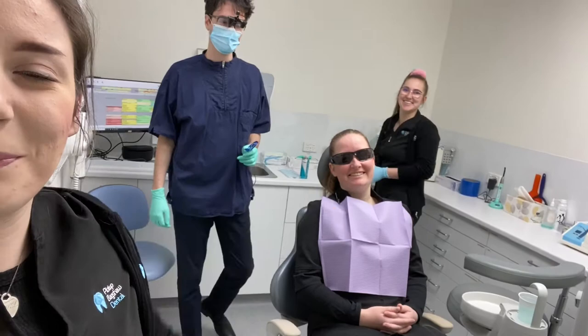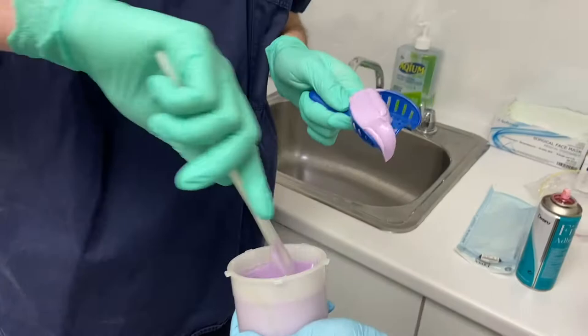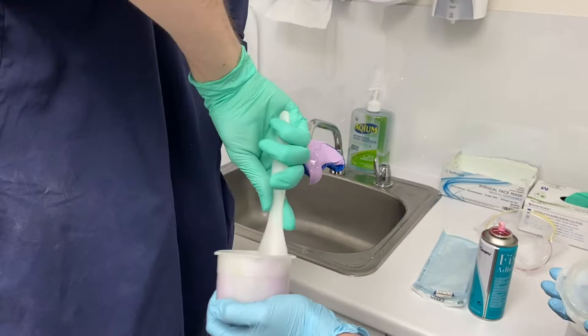Hey guys! So this is Jess. Emma's going to help us mix the impression material and Chris is going to take the impression. Chris is getting the alginate impression material out and putting it in one of the impression trays.